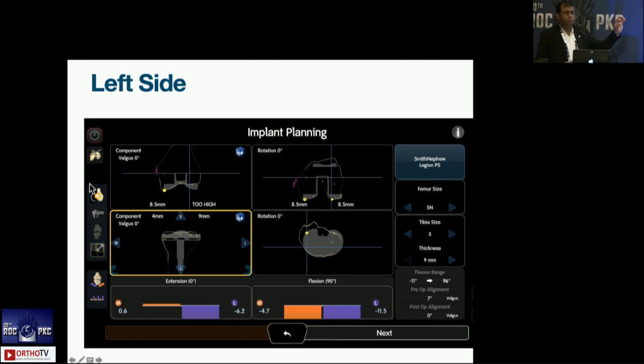Yeah. So the key point here is to look at the normal corner. So you have a large valgus deformity, you look at the normal corner and you want to get. So the only corner that I'm worried about will be, because this is a valgus deformity, the orange part. So the thing that I want to get is that 4.7 should become 0. And how do you do that? How do you increase the gap on the posteromedial side? Either increase tibial slope, increase tibial cut, or anteriorize the femur. So all of those can be used.